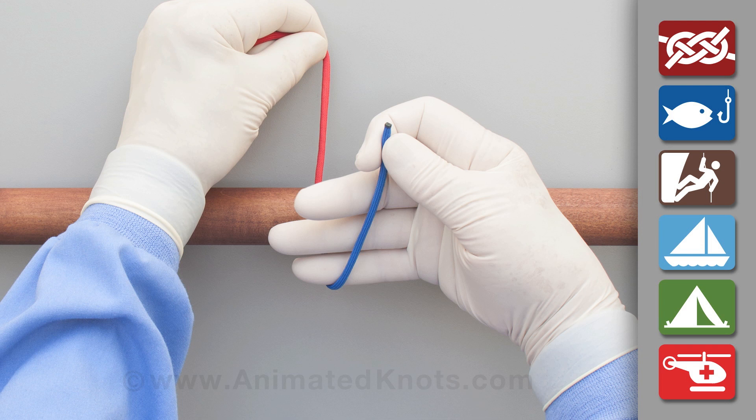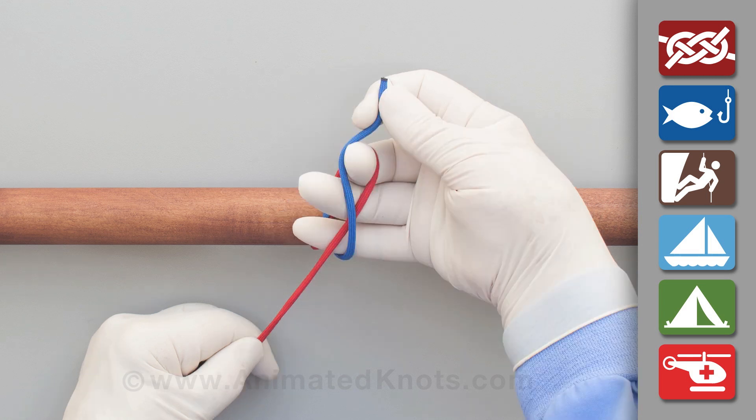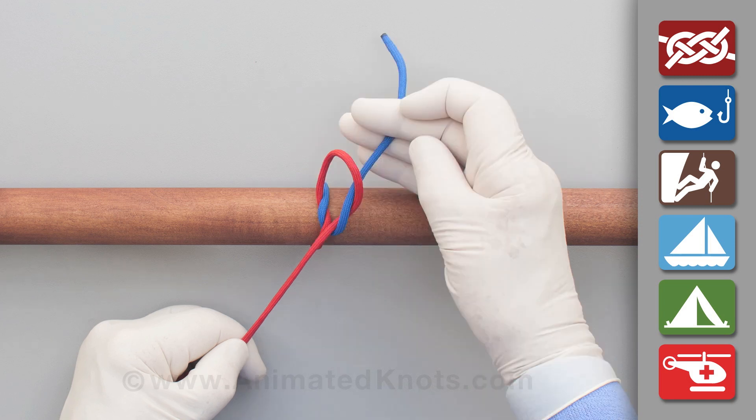Lay the short end across your fingers with the long end across in the opposite direction. Now use your middle finger to first pull the long end under the short and then hook the short end through to complete the square knot or reef knot, and pull it tight.